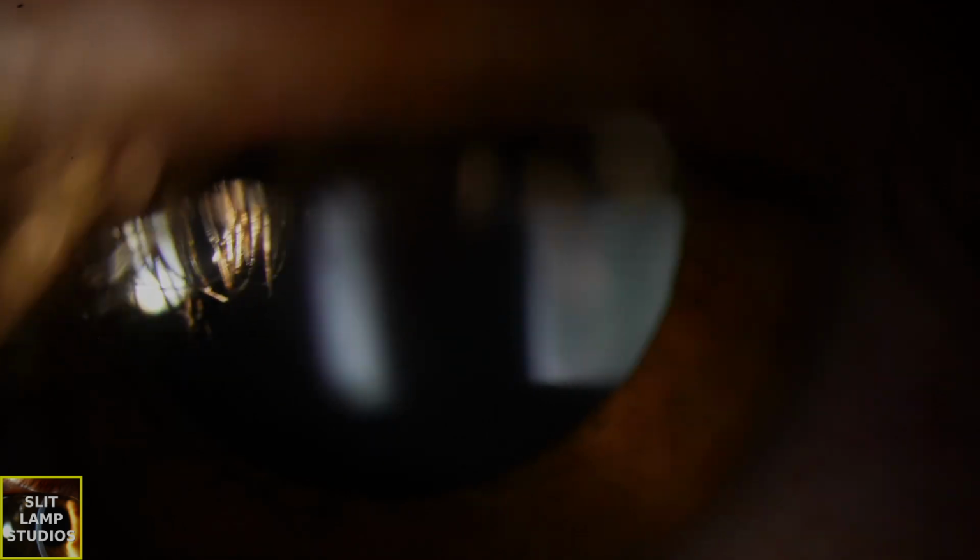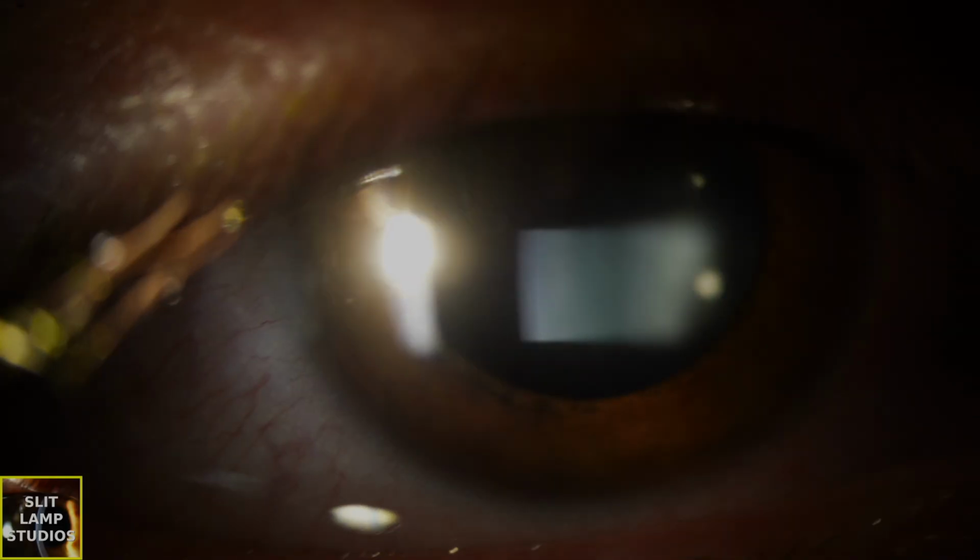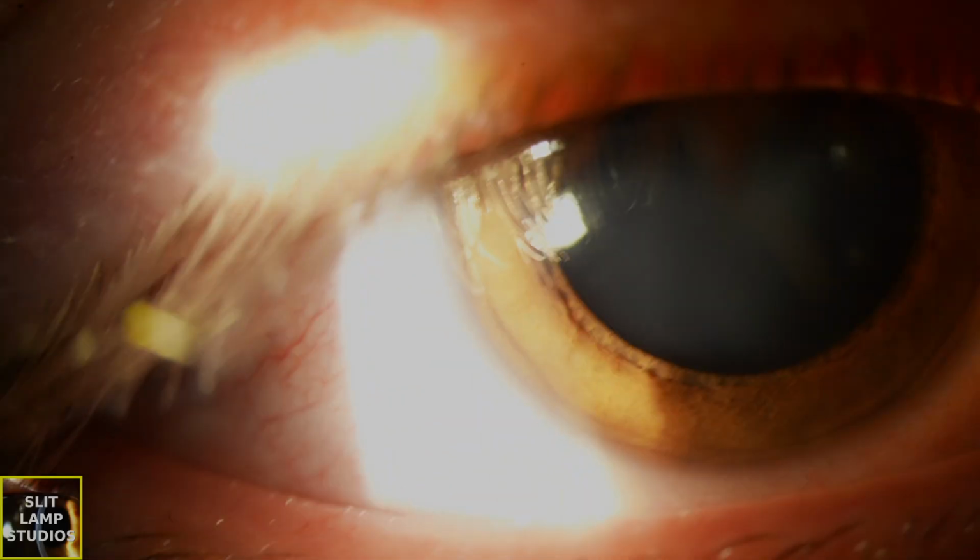And what you're seeing in the anterior vitreous there is actually a Mittendorf's dot, and we're going to go into that in a bit more detail in future videos, so don't worry about that. But let's focus on what we're seeing for now.